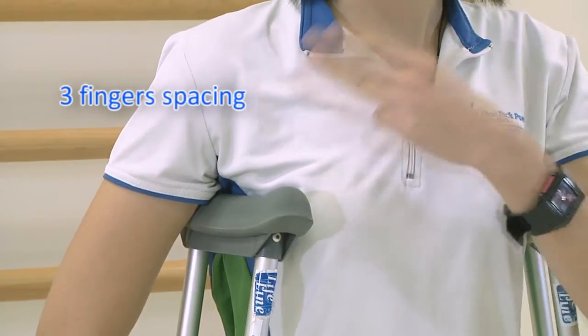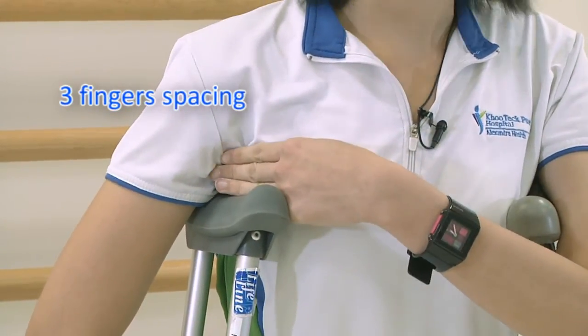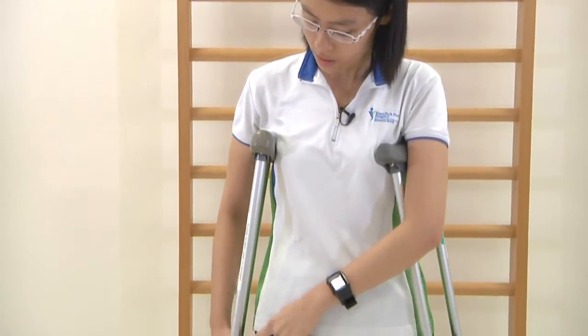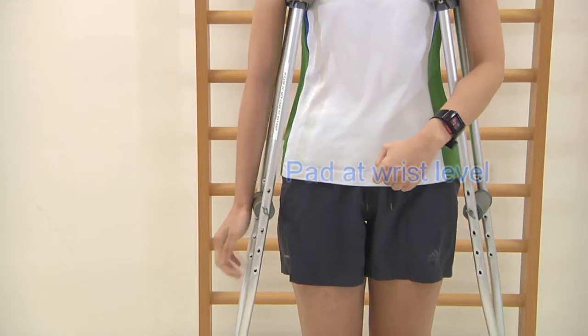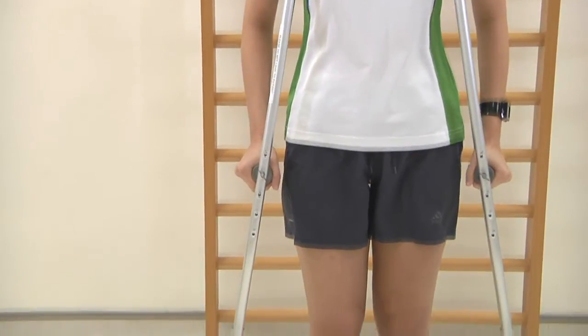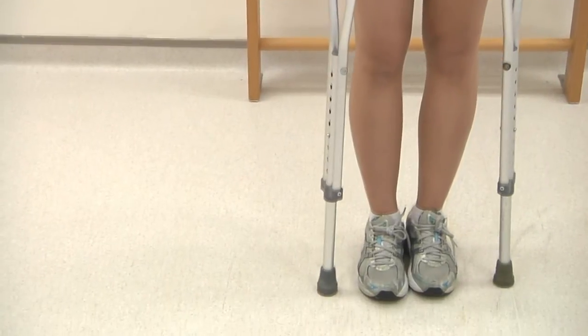The correct height of a crutch should be three finger spacing between the armpit and the top of the pad. The correct height of the hand pad should be at the wrist level. The correct space between your feet and the base of the crutch should be about six inches.